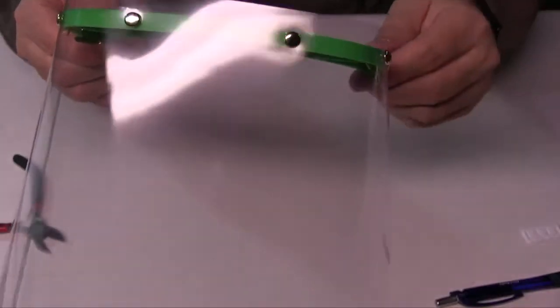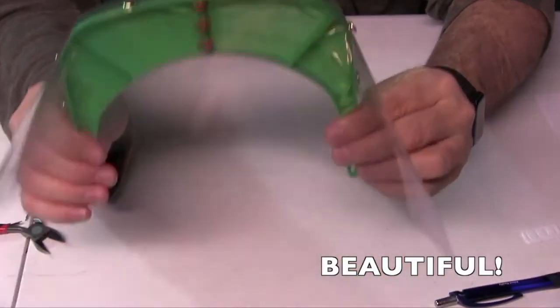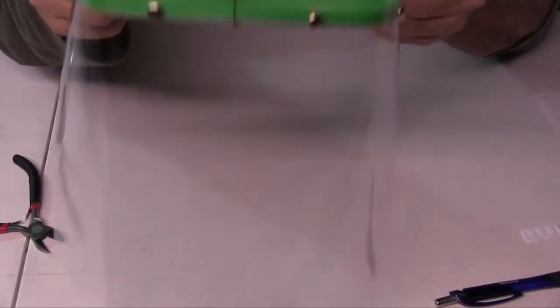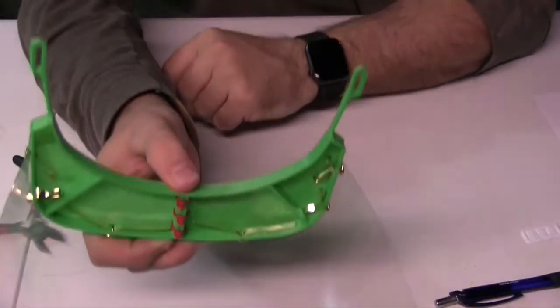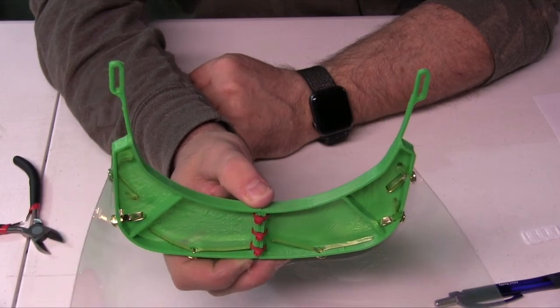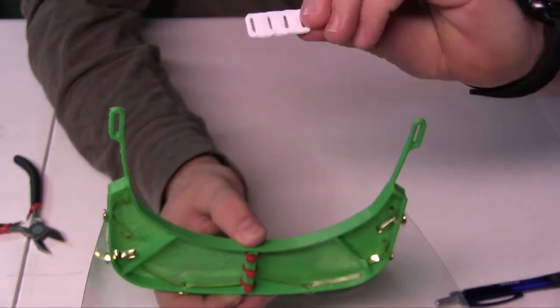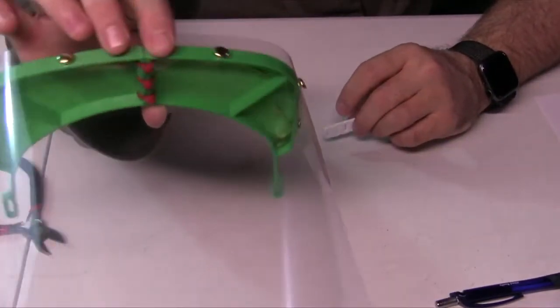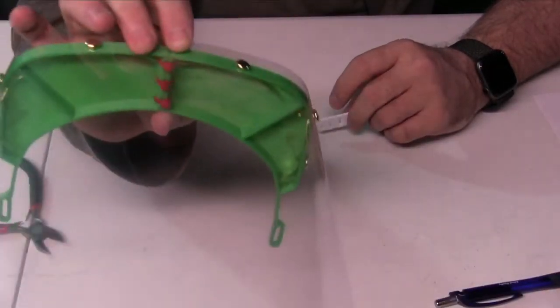But there we have it. We have this on the outside. It looks elegant. Here we have our face shield attached with the metal brads going across, and there's our pretty much completed PPE. The last part here will be attaching these ribbons and using, if you have available, this little piece right here, which enables you to tie the ribbons to the back of your head. So that's the next piece I'll look at. So that's how you attach the face shield using metal brads to the 3D printed frame.